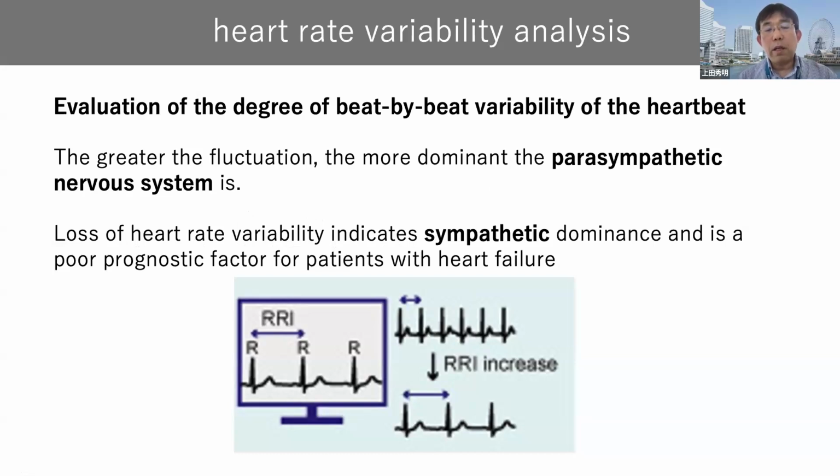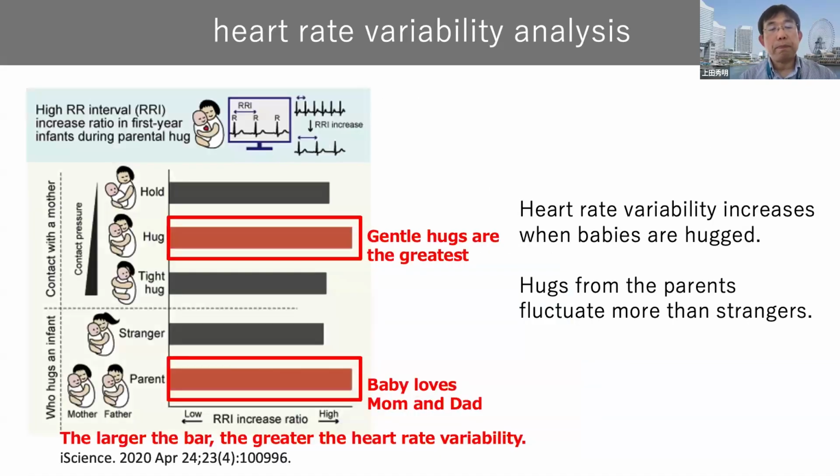So whenever we see the heart rate rise and there is no heart rate variability, it's a very bad condition. We have to move on to further treatment.